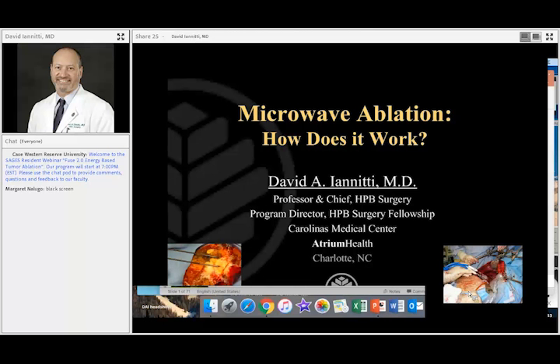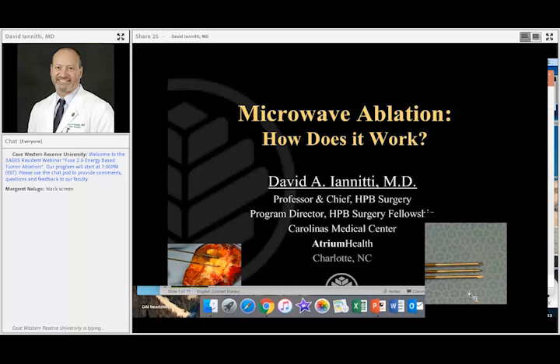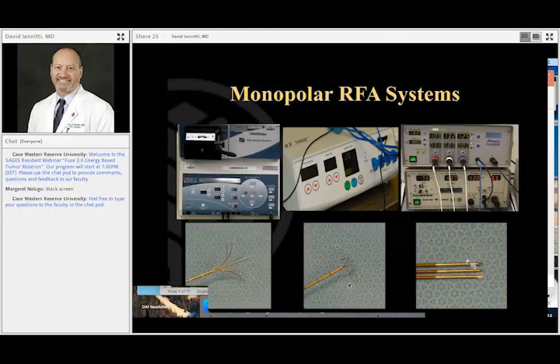So my talk today is how does microwave work? Again, I'm not going to go through all of this, but there are obviously many different ways to destroy tumors, most commonly microwave, radiofrequency, cryo, and IRE. As Dr. Choi mentioned, there are monopolar radiofrequency ablation systems that have been commercially available since 1997. There are different types of systems: those with deployable arrays and those with straight needles, usually cooling the tips.